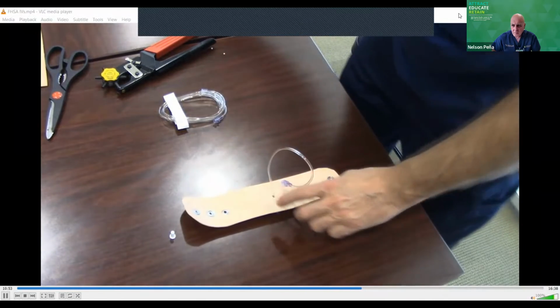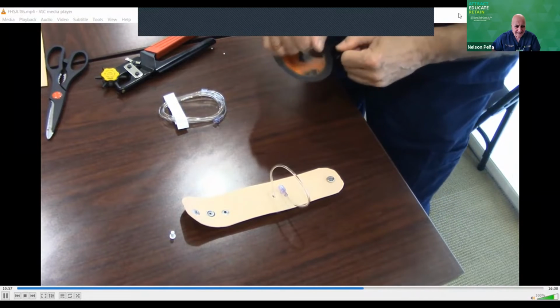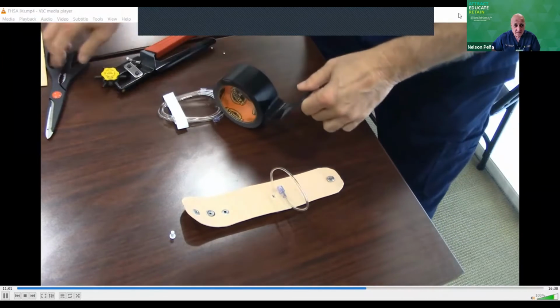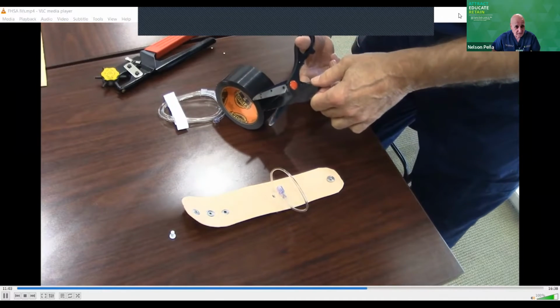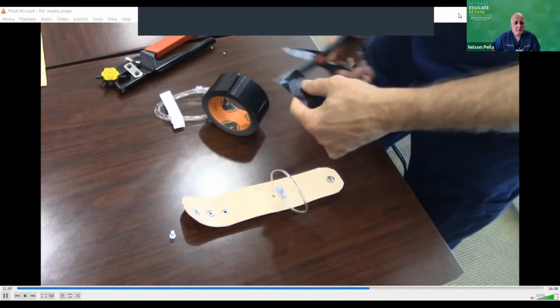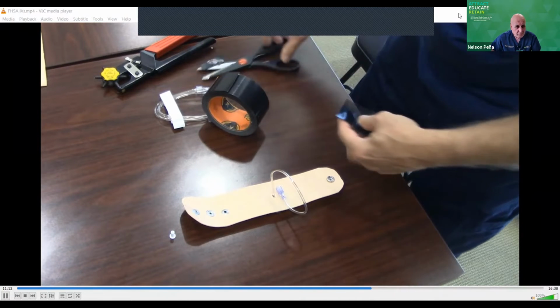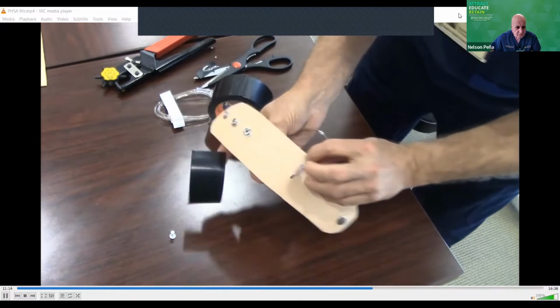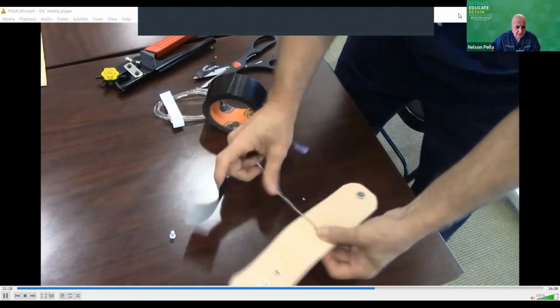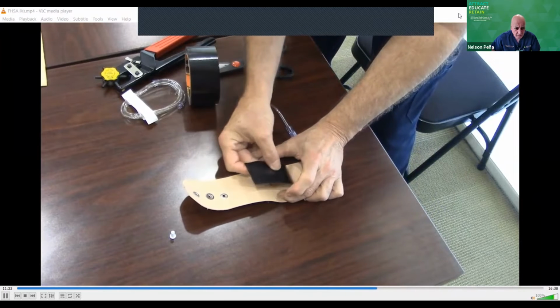So now I need to cut myself a piece of tape from the Gorilla Tape. Stuff is strong, and that's the good thing about it, is once you get it on there, it stays on there. So you cut yourself a nice piece off. And now, making sure I have this just where I want it, I'm going to go ahead and put the tape over the top of it.